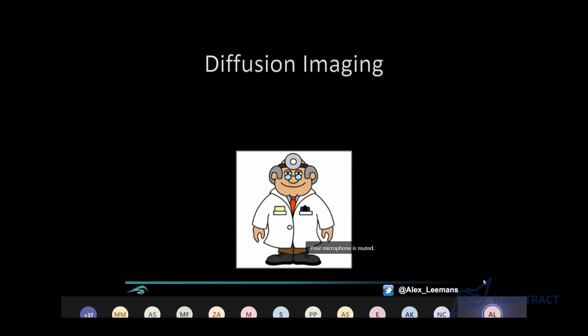All right. So now we're approaching diffusion imaging in short, right? So diffusion MRI, diffusion tensor MRI is something we'll come back to in a moment. But you have to keep in mind that diffusion tensor MRI is already like a step further. If you're talking about diffusion MRI, you would be looking more at diffusion weighted imaging. This is kind of where it originated. And I always make the joke, we don't call it diffusion imaging anymore. Sometimes we call it confusion imaging because it's so complicated, especially in the medical arena.